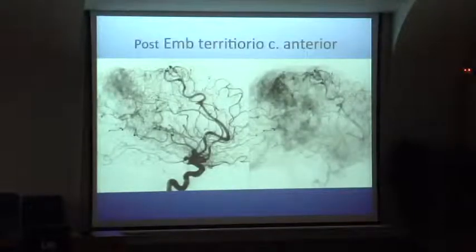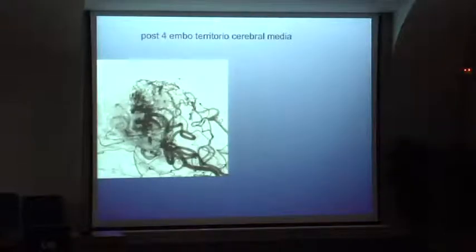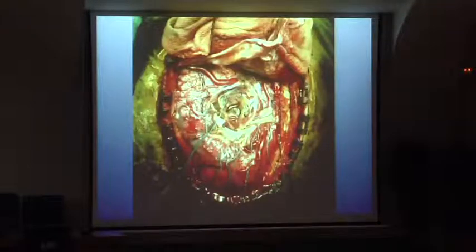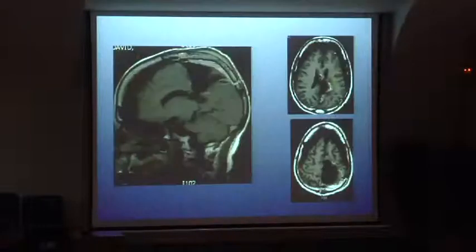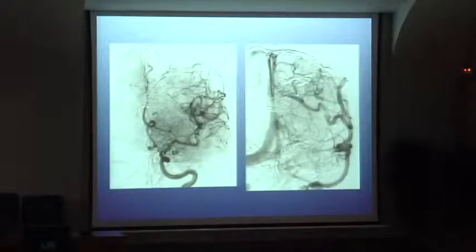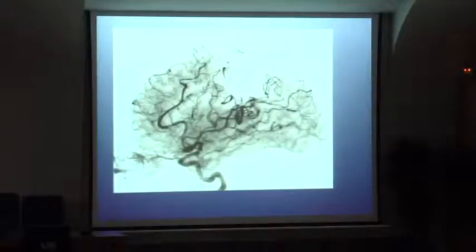This is the control, final control. Next. And going to surgery. Next. And this is total removal of the AVM, total cure. The patient has only an arm deficit, and this is well. Next. This is the control.